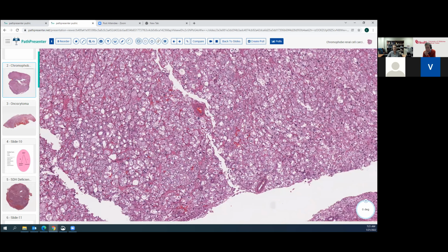So let's look at the interface here. So we've got another, this might actually be a nephrectomy. Let's see. Got some nice renal parenchyma squished into the capsule from the tumor. Just follow it around. It's hard to tell if this is a partial nephrectomy or a radical nephrectomy, but overall, it looks like there isn't very much invasion into the renal parenchyma. It's confined to the kidney.